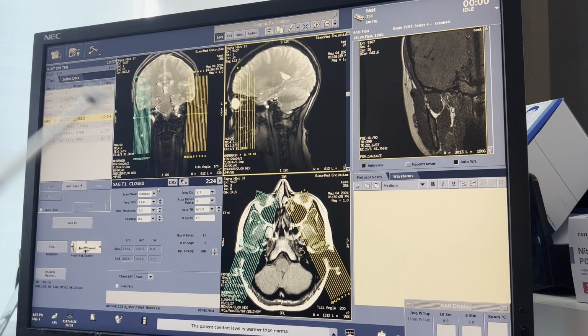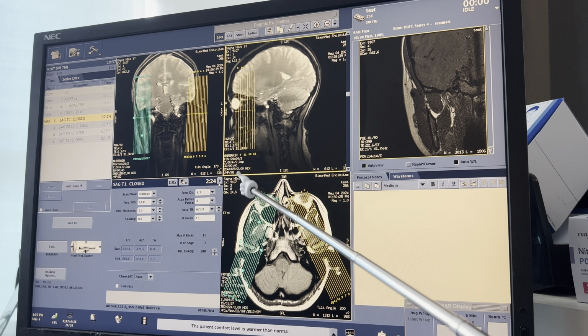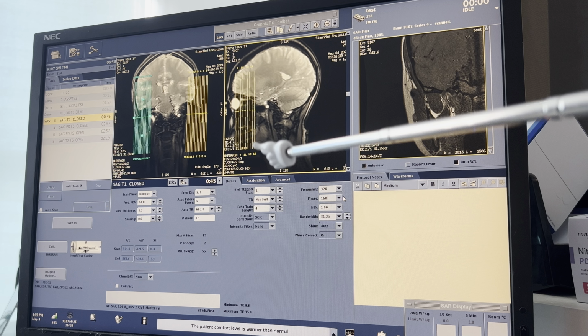Again, we are referencing these are just barely below the level of Shrek's ears or those IACs, the vestibulocochlear nerve, so it looks good. Again, because it's not clinical practice, we're going to shorten these up. We'll do 1 and drop the phase. Okay, let's scan.